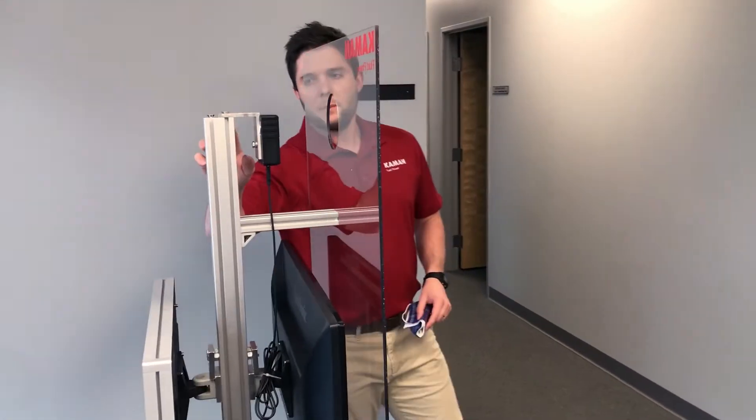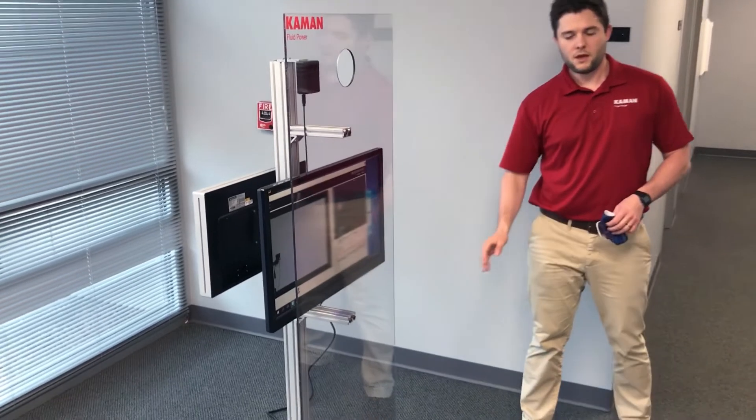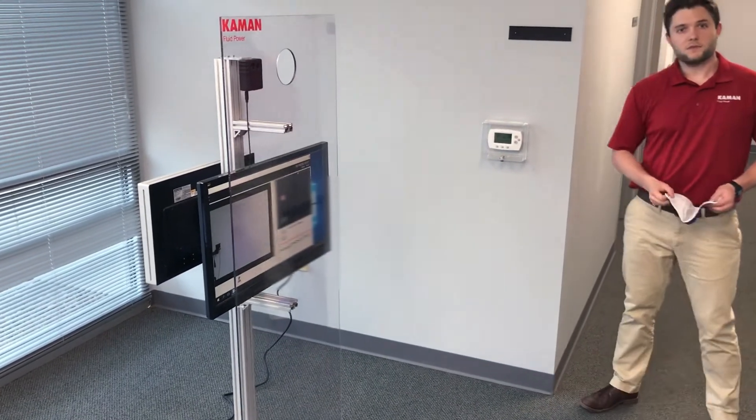This is all mounted on top of an aluminum cart with casters on the bottom for easy mobility, and I'm going to show you what the process of the screening looks like.